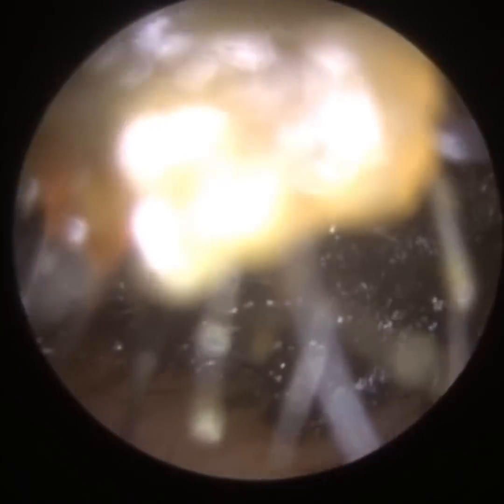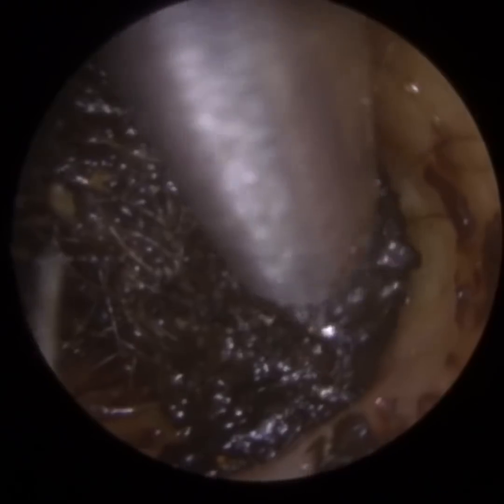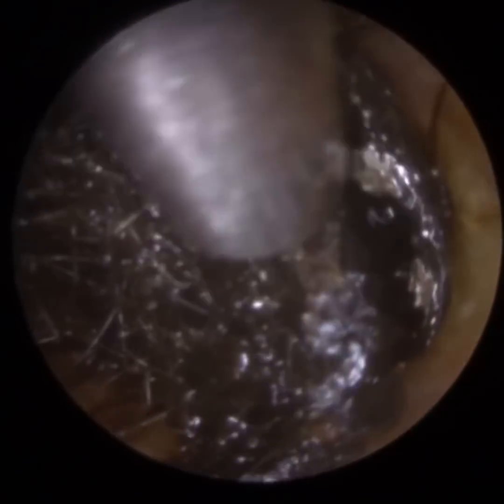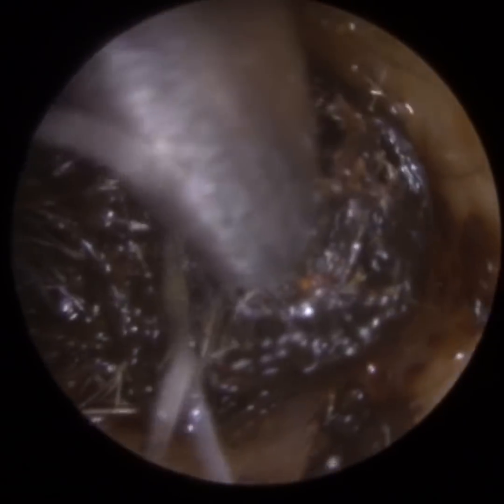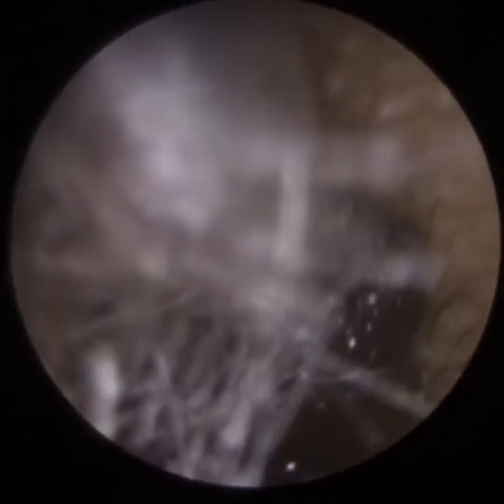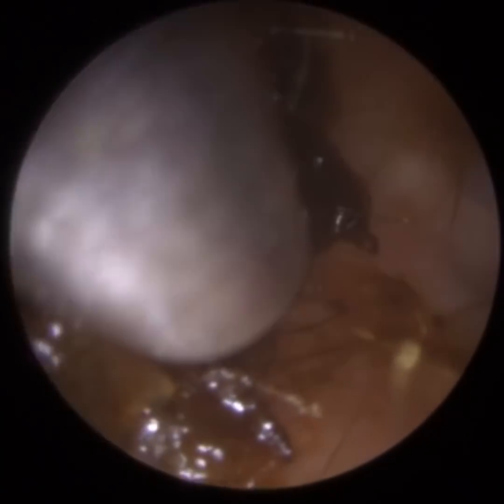You can see the view we've got — a really wide field of view with the iClearScope, our wireless endoscope. This last part of wax is really against the eardrum, lodged in the isthmus. The isthmus is a narrowing — it's a generic term, not exclusive to just the ear. In the ear canal itself you have two narrowings: the first is where the cartilaginous portion of the ear canal, the outer third, meets the inner two thirds, the bony part, also known as the osseo-cartilaginous juncture — about a centimetre into the ear canal. The second narrowing is about half a centimetre away from the eardrum.